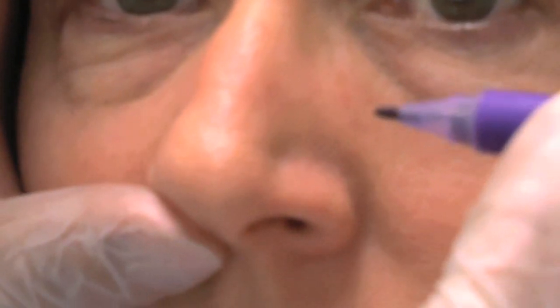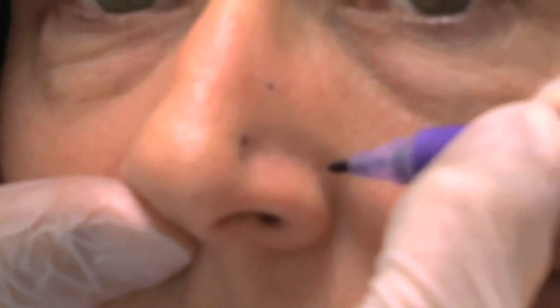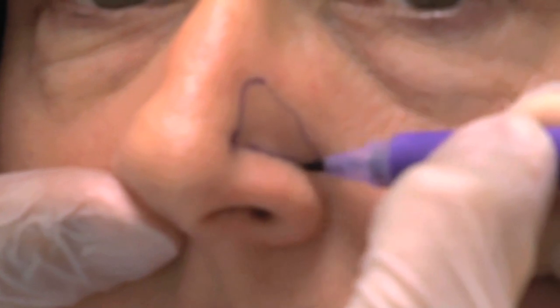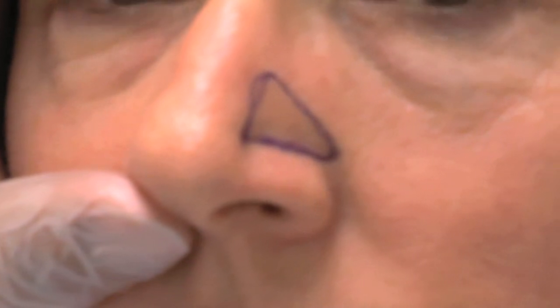I am going to mark the area of maximal collapse because that will show us where we need to place our graft for maximal result. Take a deep breath, please. Take a deep breath, please.